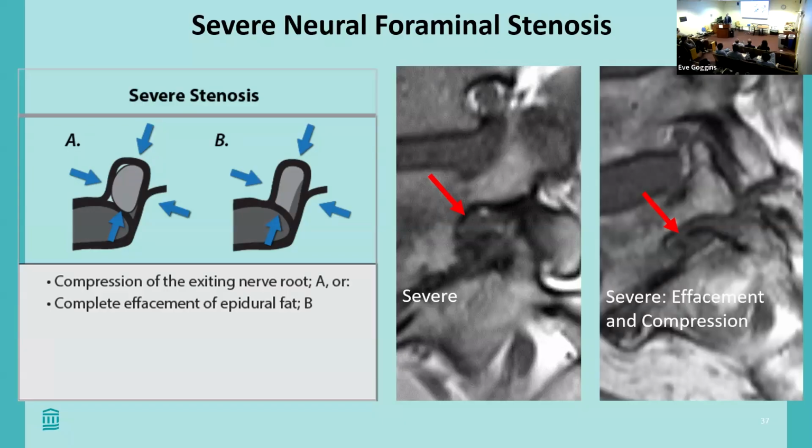I have a question. Yeah. How do you use this in the cervical spine, given that the sagittals look so much different on the lumbar? That's a wonderful question. And a couple of people have asked me, and if you're interested in working on a project, we can do the same thing for the cervical spine, but this is just for lumbar spine. Okay. Yeah, cervical spine is a totally different beast that I think is much more challenging for everybody, including me.